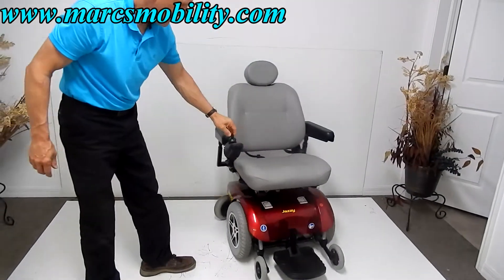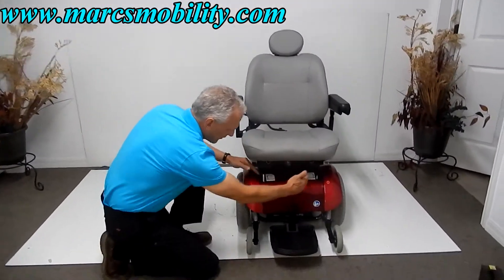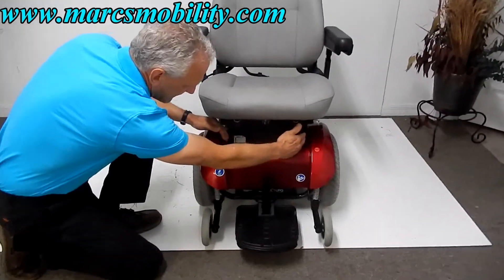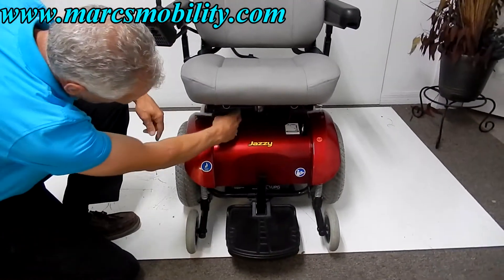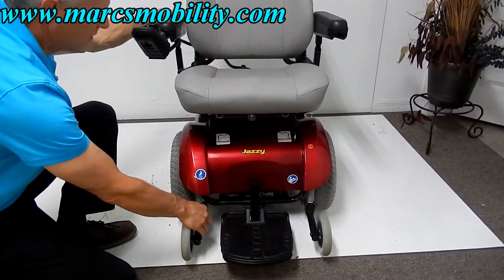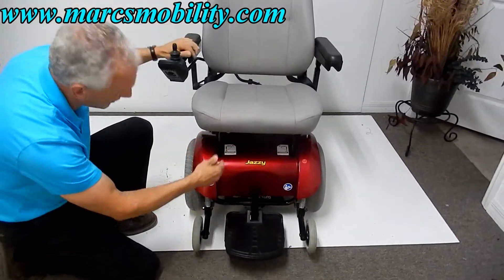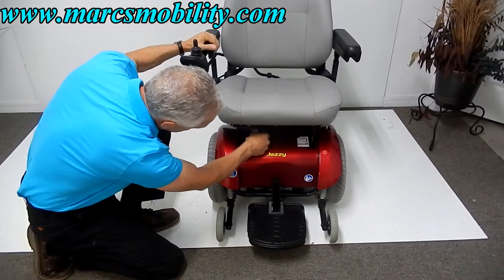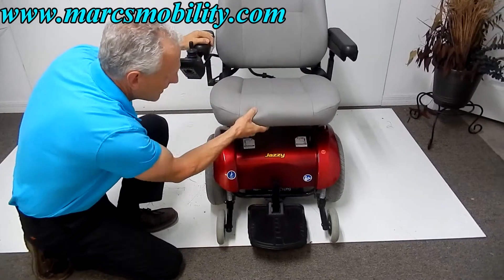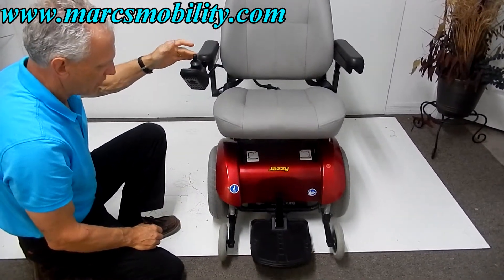If you want to put this chair in neutral, there are two levers. The levers on this Jazzy 14 XL are right here — you can flip them towards the front and the chair is in neutral. It's a very easy chair to push; it rolls with two fingers. Turn the levers back inward and turn the power back on and you're ready to go.